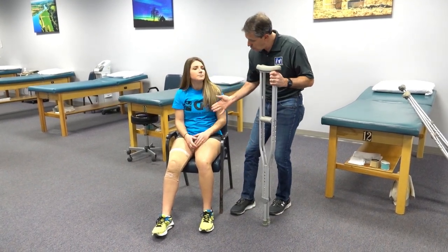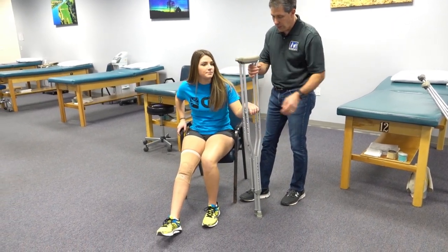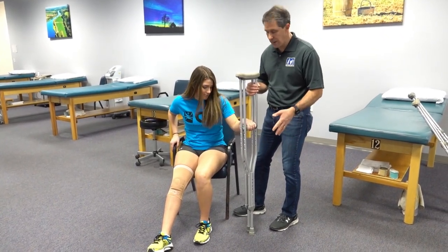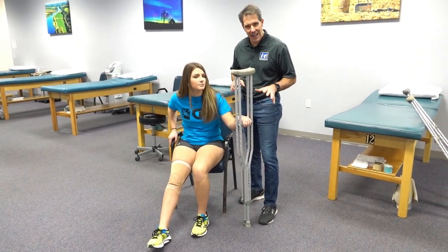Again, we are going to scoot toward the end of the chair so you're closer to the front. You're going to have one hand on both crutches right here — make sure that it is on a stable surface, not on a slippery surface where the crutches can come out from under you. Remember, you're not pushing off really hard on the crutches; the crutches are there for just a little bit of balance.